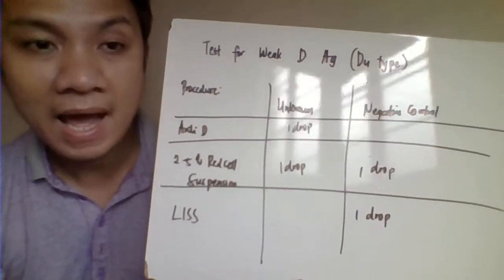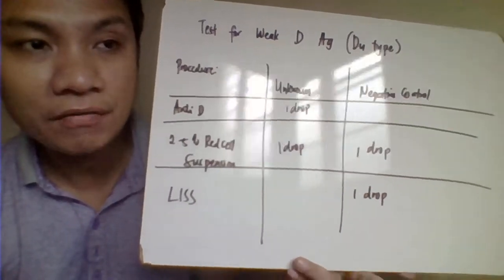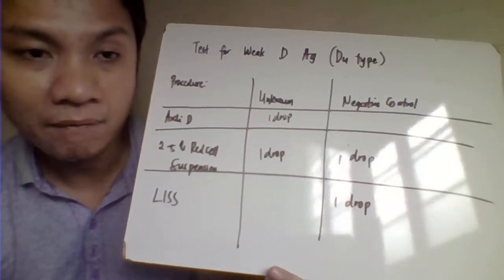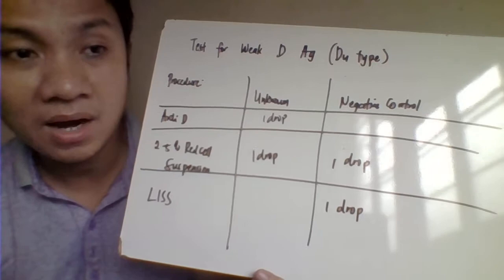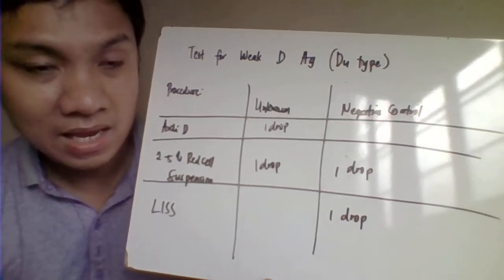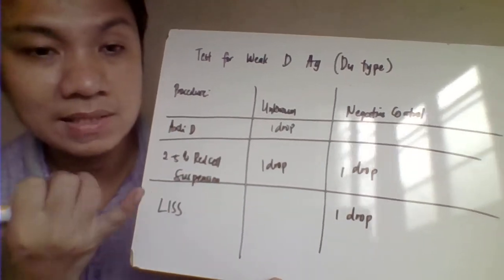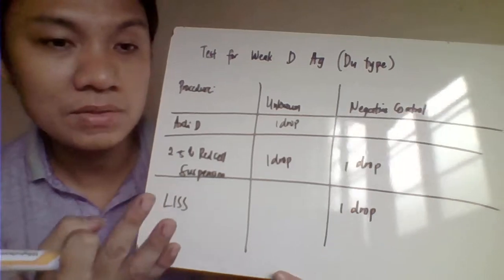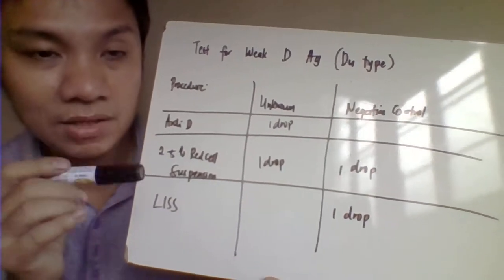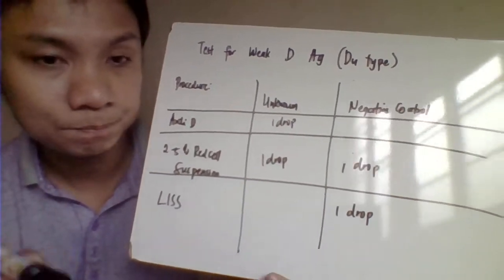Therefore, we can enhance our agglutination reaction by addition of your anti-human globulin in order for us to confirm if the patient has a weak D, or the patient's really negative for the RHD. So for the weak variants, those three, genetic weak D, C-trans, partial D or D mosaic, when we report, we consider them as RHD positive still.